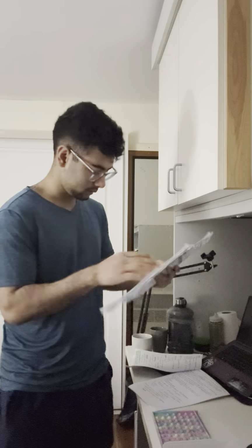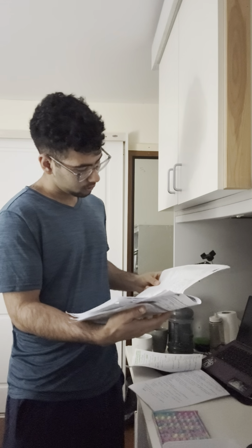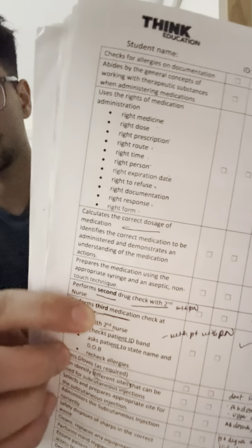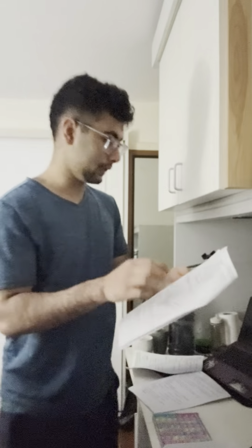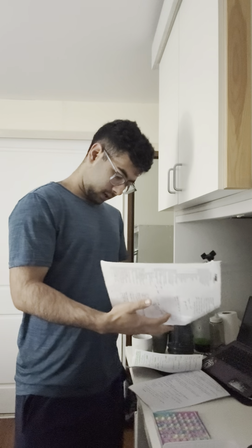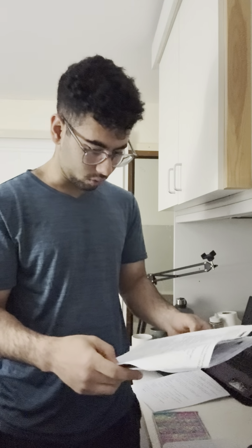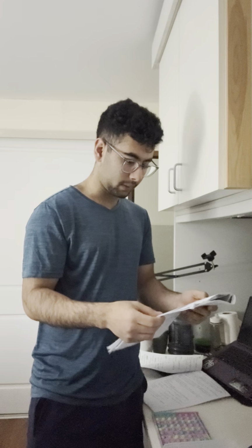So for subcutaneous, you need to know what items you need. First you need to do 11 checks, and after that you need to do three medication checks, as you can see here. It says second check and third check, right? The first check is over here. So that is how you do the checks, and if you can just stick with those, and if you know what you are giving and what exactly you are doing, then I reckon there won't be any problem, because it's just about explaining the things that you do over time.